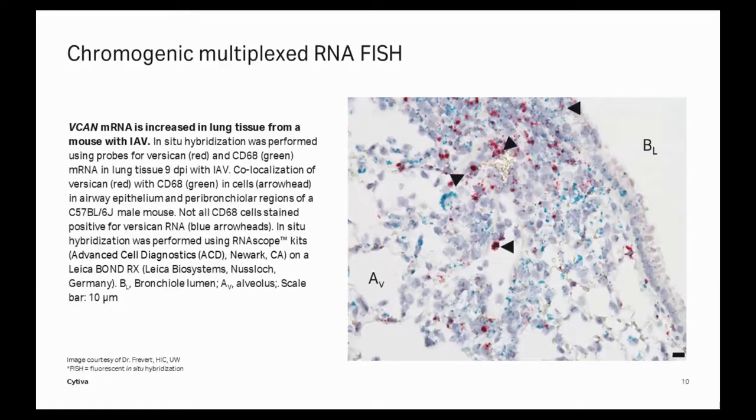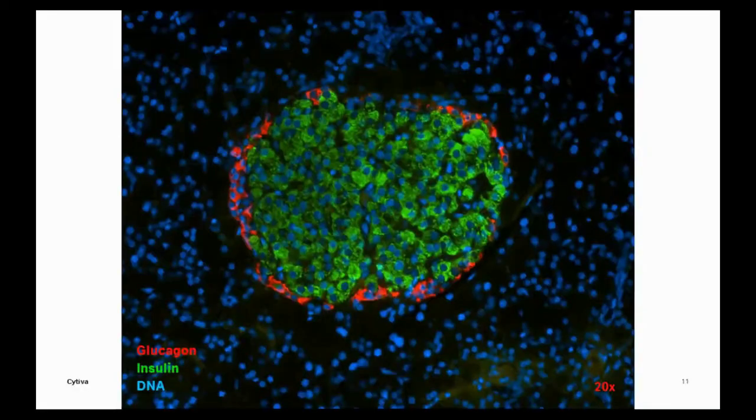And the background of purple. And so you're trying to see pink and blue and purple all on top of each other. And so that limits our ability to see staining with chromogenic stain. But if we look on the other side, we can see with fluorescence, we can see more colors.